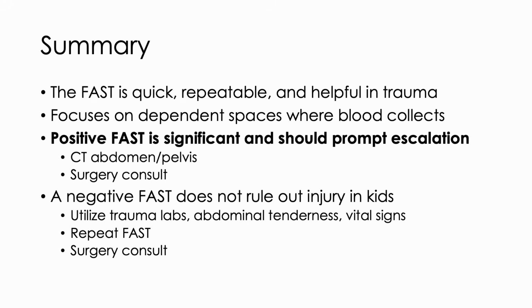It focuses on finding fluid where it shouldn't be in dependent spaces where blood could collect. A positive FAST is significant and should always prompt escalation, consulting your surgical colleagues and ordering of a CT abdomen and pelvis. A negative FAST does not rule out injury in kids, so remember to utilize your other resources like trauma labs, trend their vital signs, and check for abdominal tenderness with repeat examinations. You can also repeat a FAST exam if needed, and you can always talk to your friendly surgical colleagues.